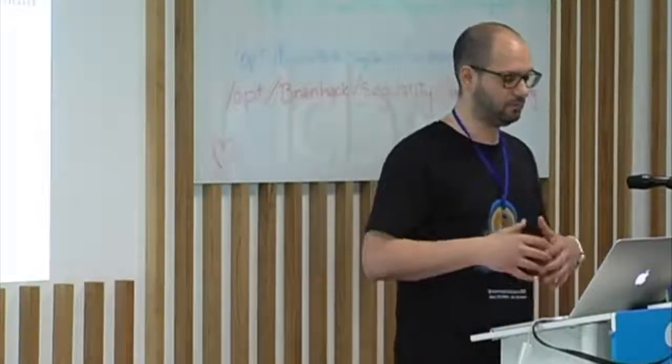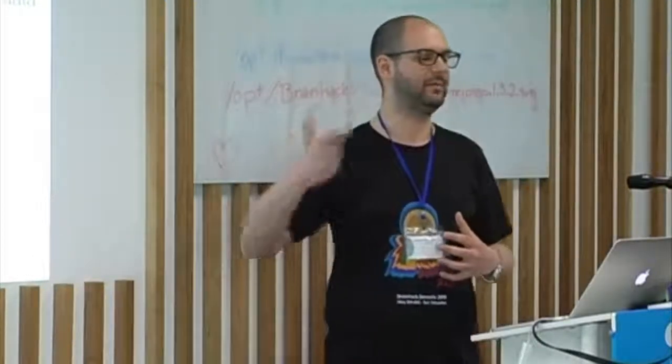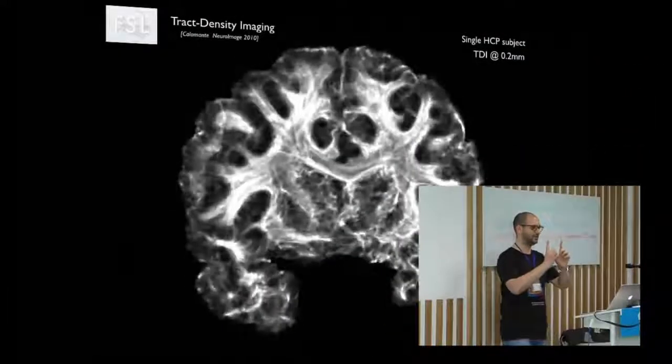To give you a more grounded way to see this dependence on the spatial resolution, try to imagine the probability maps that I showed before, the volume, and try to collapse that into a histogram, into the distribution of the probability weights. If you use a different histogram to represent exactly the same data, you perform your streamlining at 2 mm resolution, but now you do the counting on a different grid.